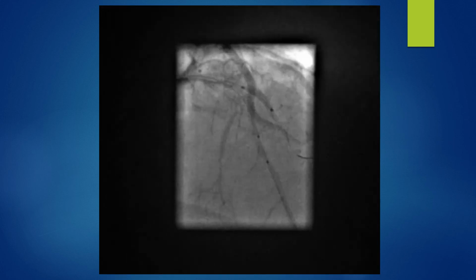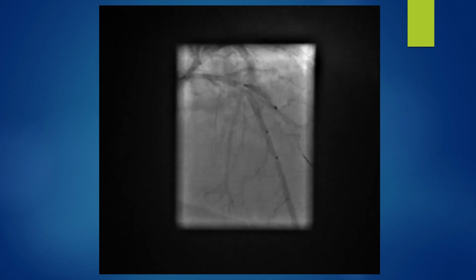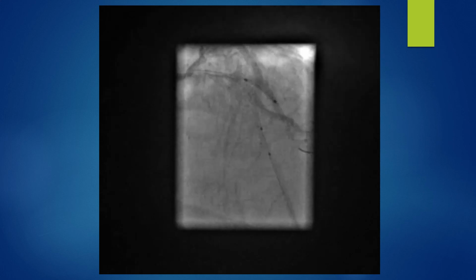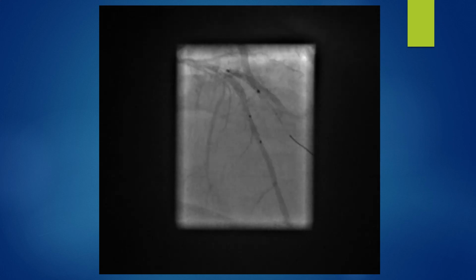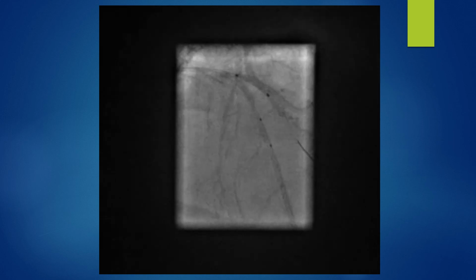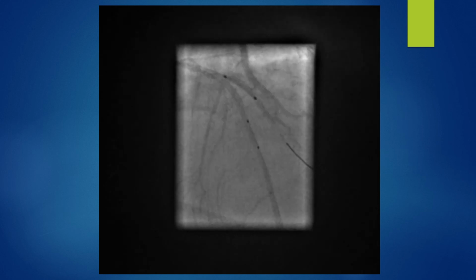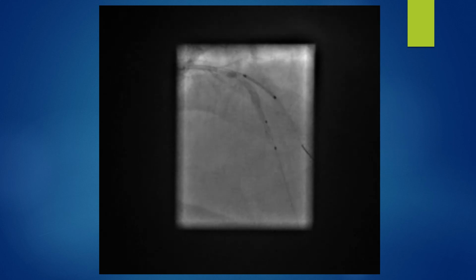First, I passed a 2.25 by 10 mm balloon in the LAD, and I passed a 2.25 by 10 mm drug-eluting stent into the diagonal branch. I positioned the stent in the diagonal branch.